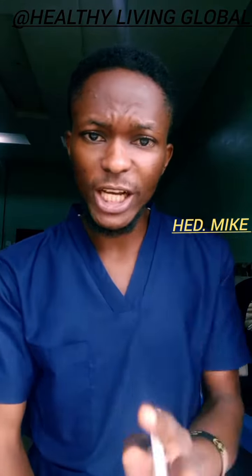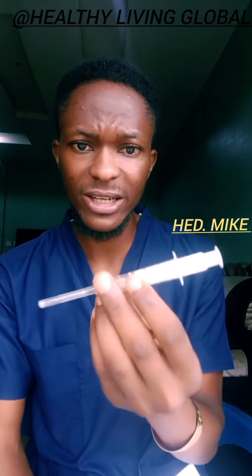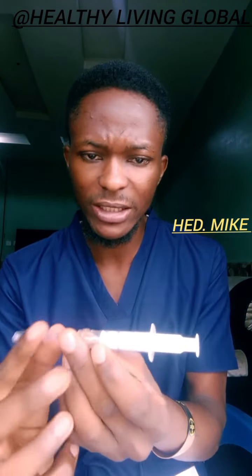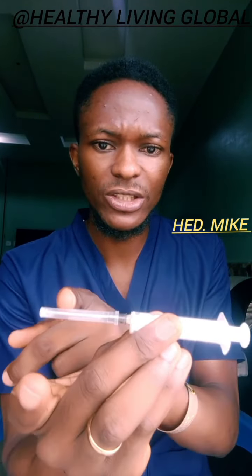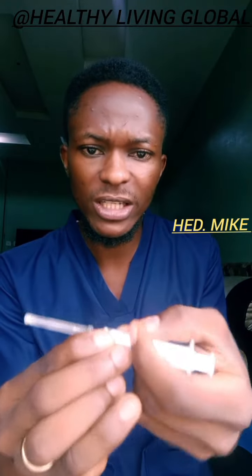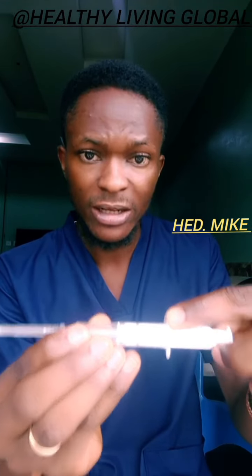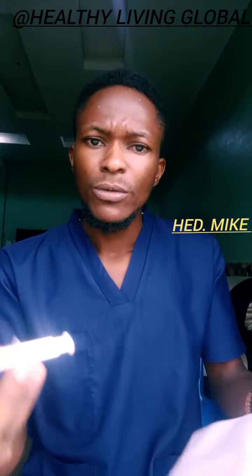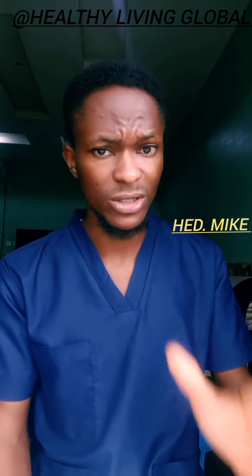Now, prepare your injection as recommended by the manufacturer. Okay, note that a syringe has different parts. Now this is the needle, this is the needle inside, and this is the cap of the needle. This one holding the medication itself is called the barrel. All right, this is the plunger. Now, if you prepare your injection, you can allow the patient to lie or stand.